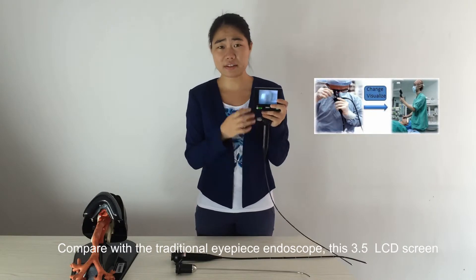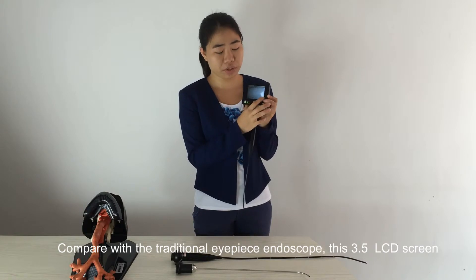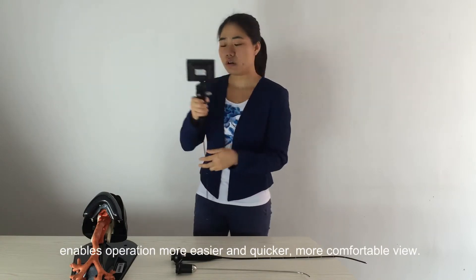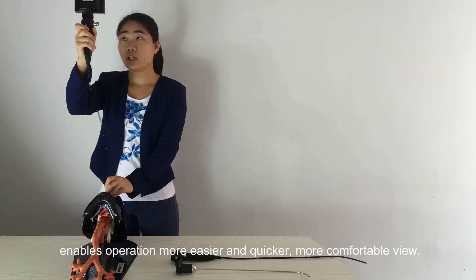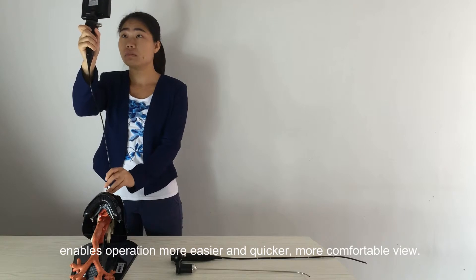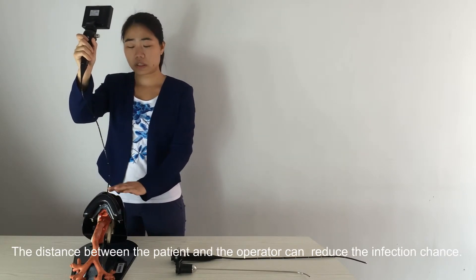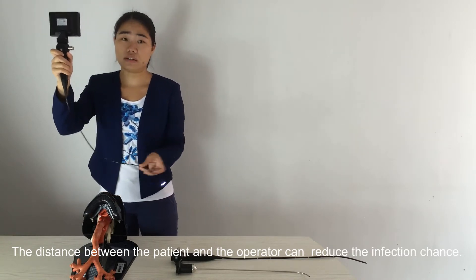Compared with the traditional eyepiece endoscope, the 3.5-inch LCD screen makes operation easier, quicker, and more comfortable. Additionally, the increased distance between the patient and operator helps reduce the chance of infection.